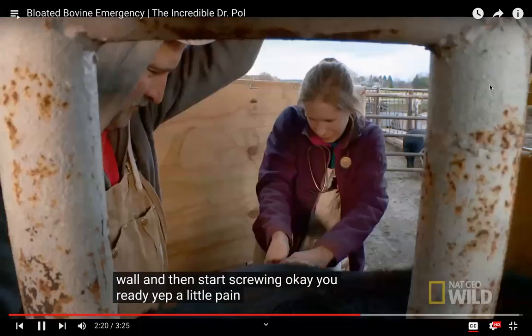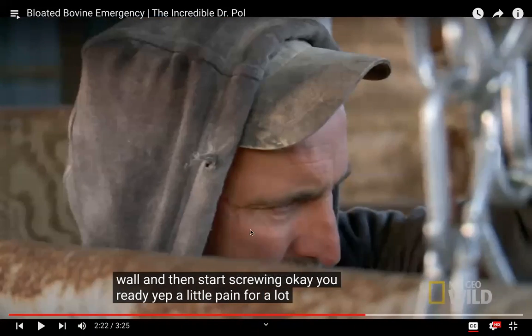A little pain for a lot of gain. I want you to listen to this, you guys. She's going to unscrew the trocar and cannula and remove the sharp stylet. And then you're going to actually hear that huge release of gas.